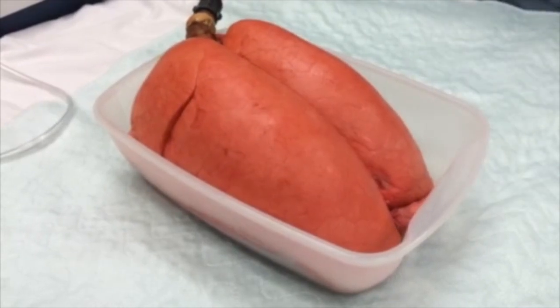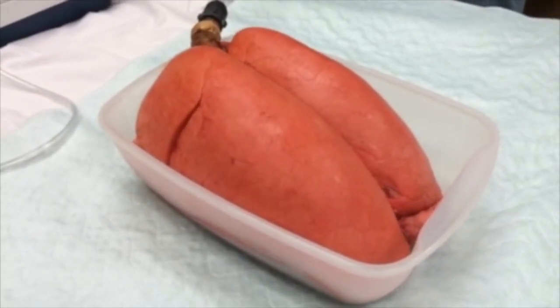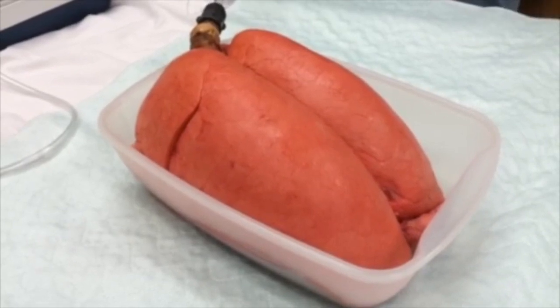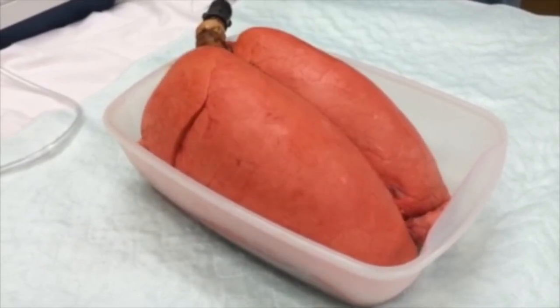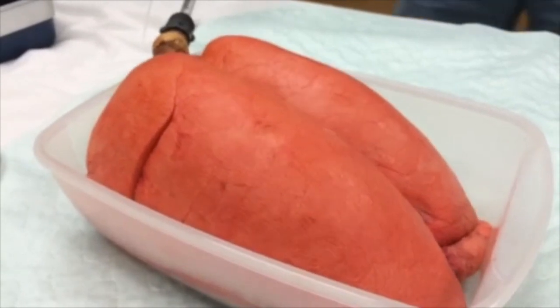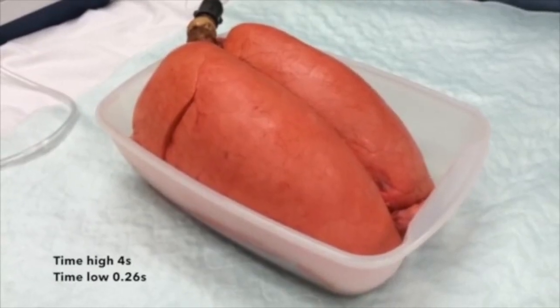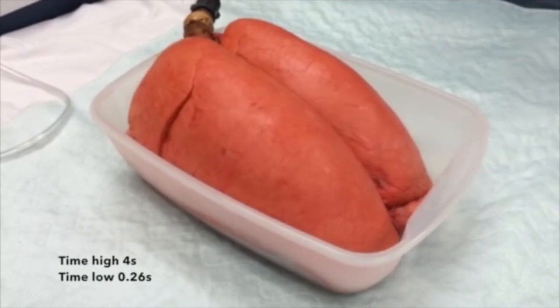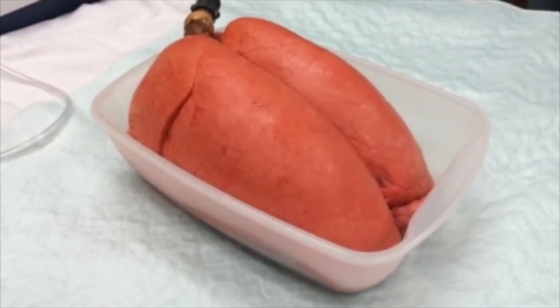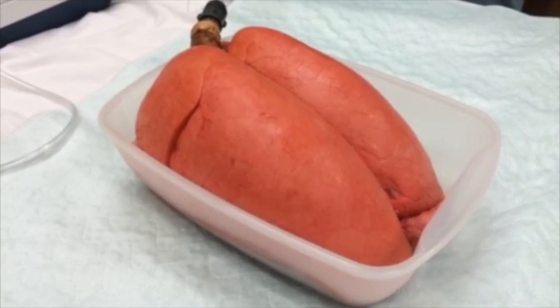These are extremely sick patients that are on APRV, usually your acute lung injuries, your ARDS patients that require a special mode of ventilation. We are seeing this a lot during this COVID-19 epidemic. Unfortunately, most transport ventilators do not have this mode built into them. There's only a fraction of the transport ventilators out there that are able to actually perform a correct APRV.